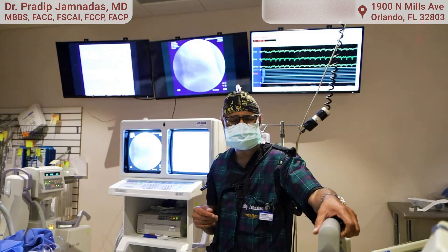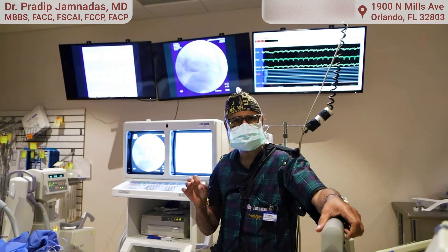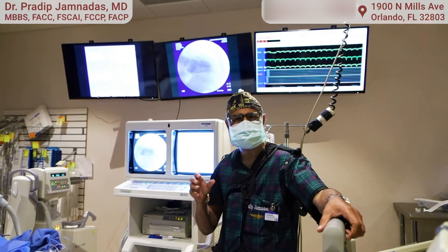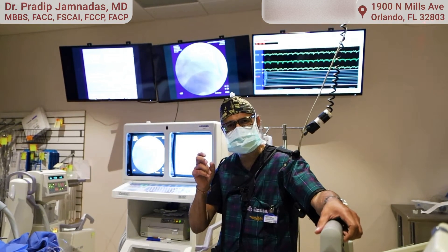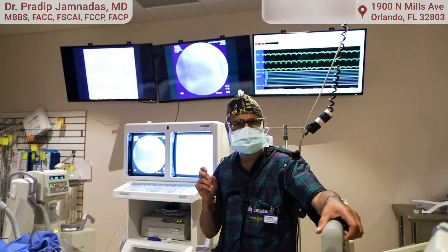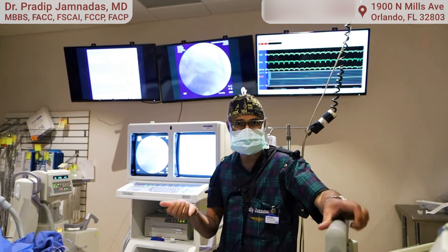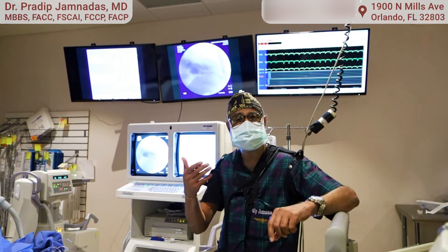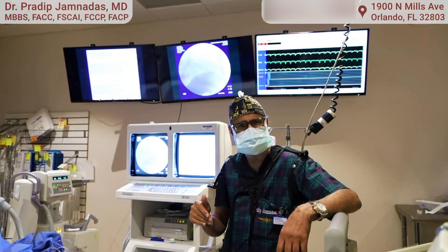We've just finished this cardiac catheterization right here in the office and we've determined the state of the arteries, the pressures in the lungs, and the heart pump — this gives us a clear-cut idea of where we need to go with the patient. In the outpatient setting the patient will be home an hour after this procedure, especially since we do it from the arm. When we do it from the leg there's usually a longer period of time that they have to stay on bed rest.